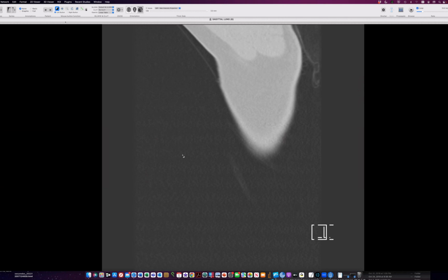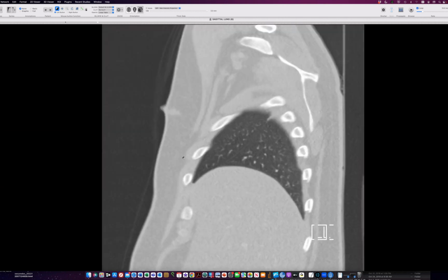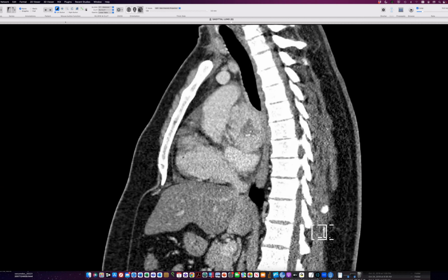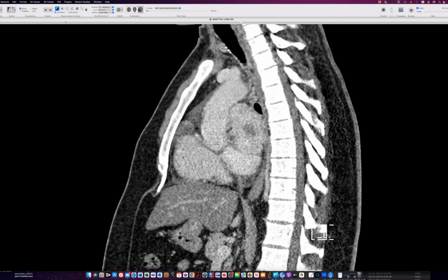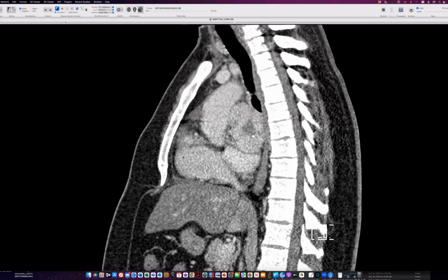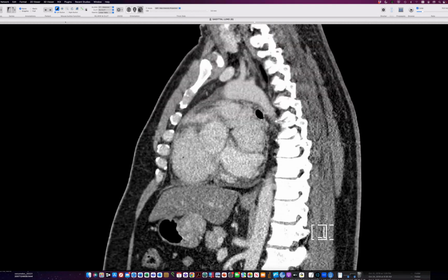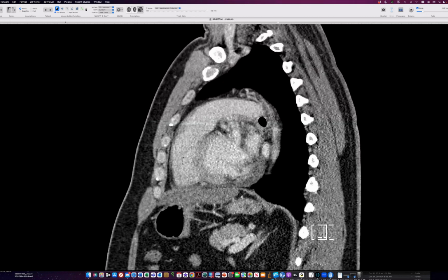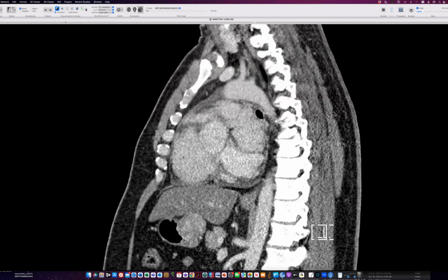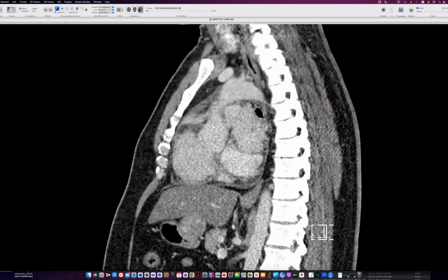Because I'm always wondering, they're labeled when they're in this location as... I have to talk to a pathologist and determine if these are intrapericardial or actually mediastinal, because there is pericardium going around it there, it looks like. Because some people list this as one of the cardiac paragangliomas in this classic location, and other people label it mediastinal. I never know.